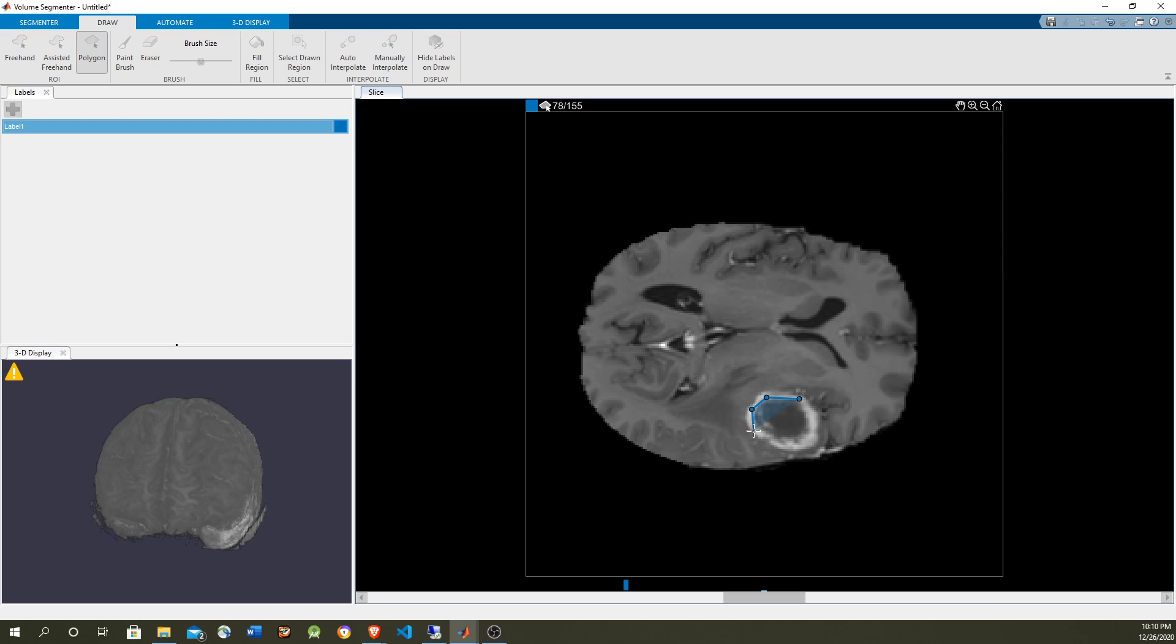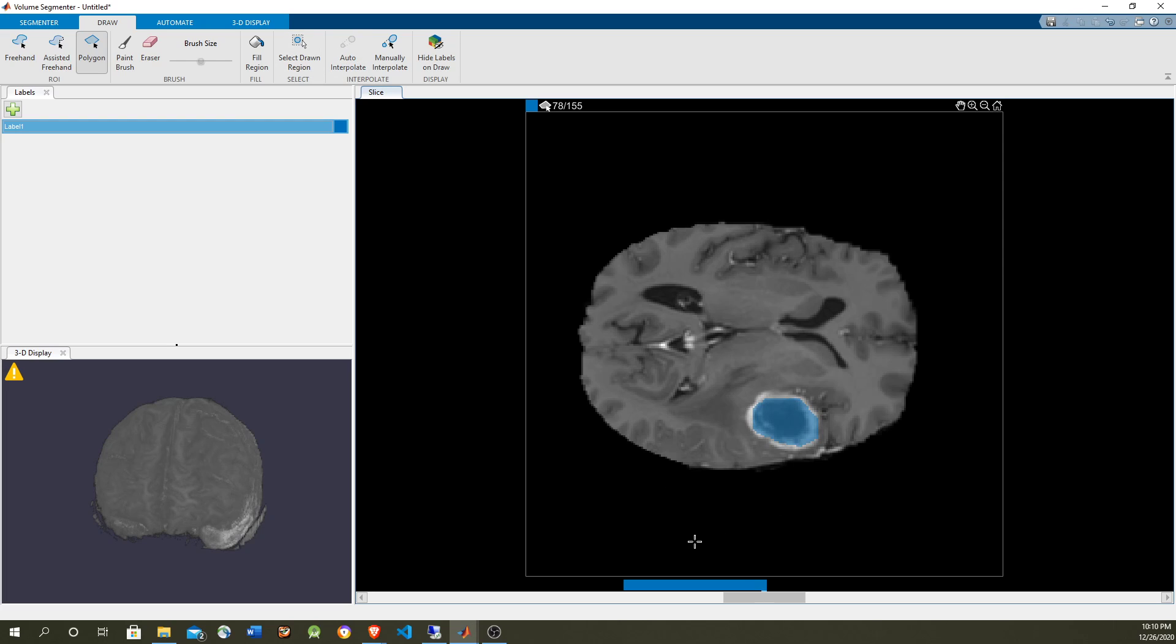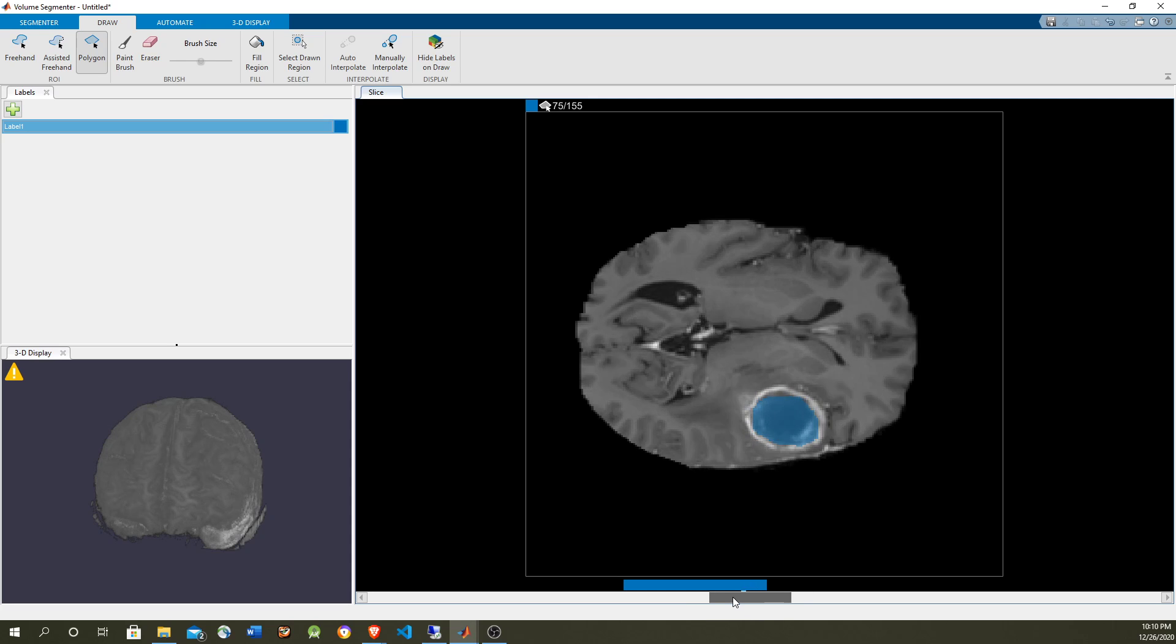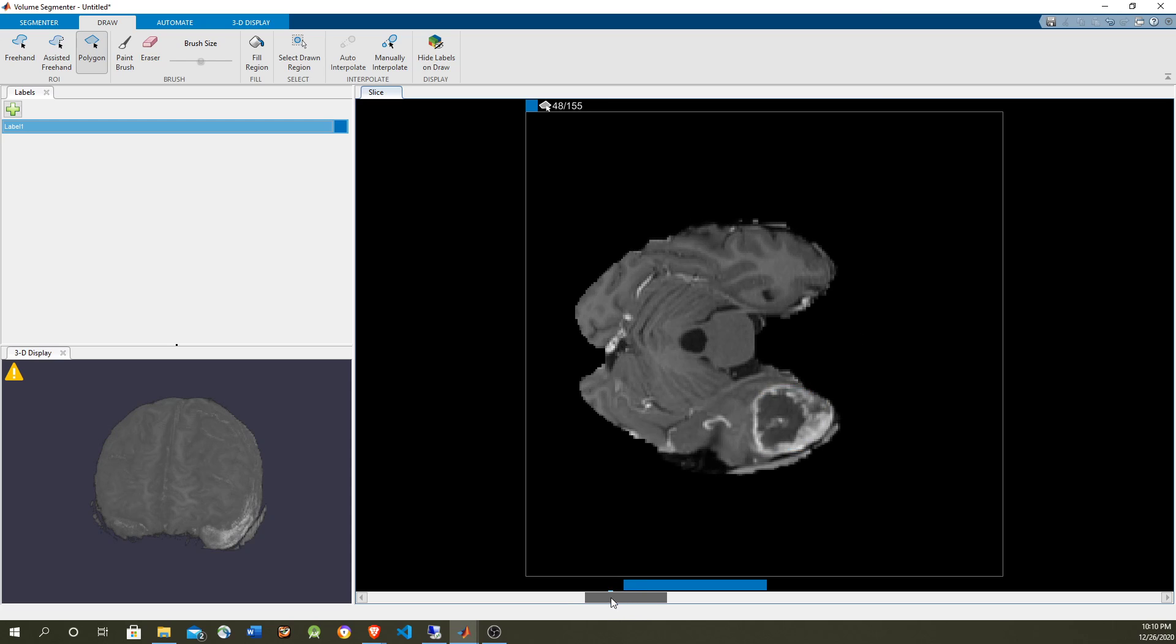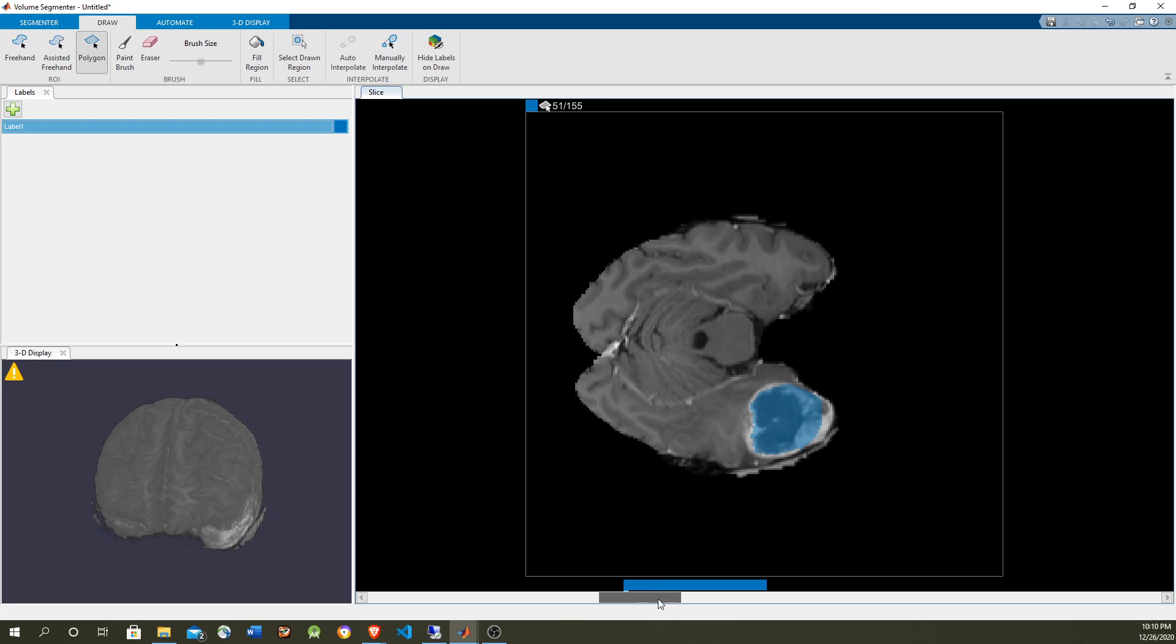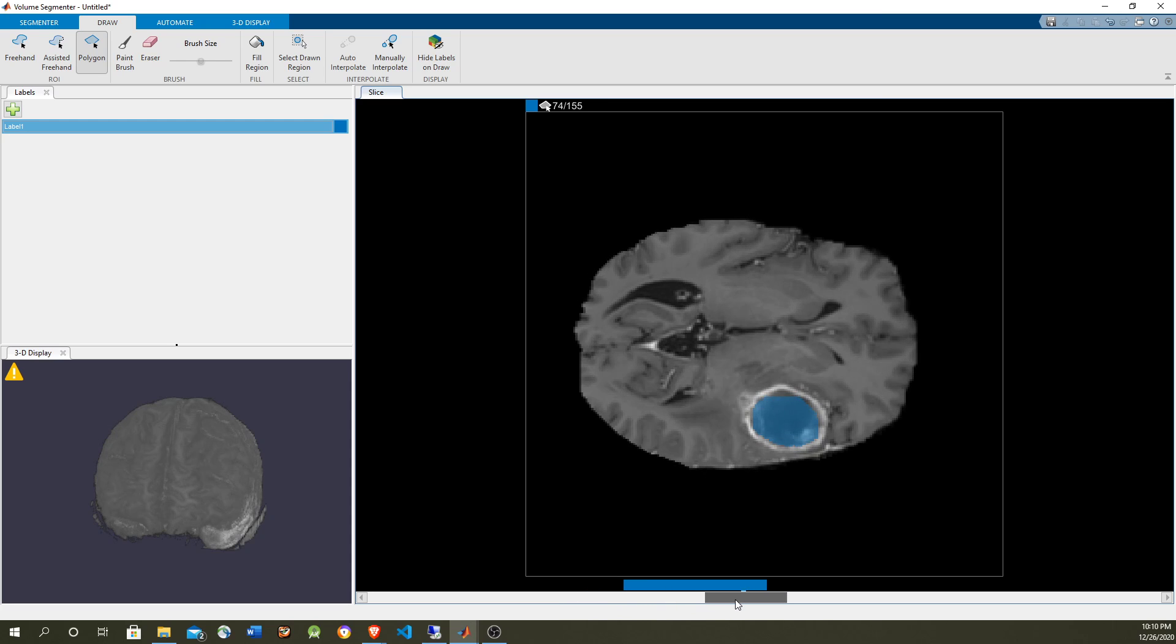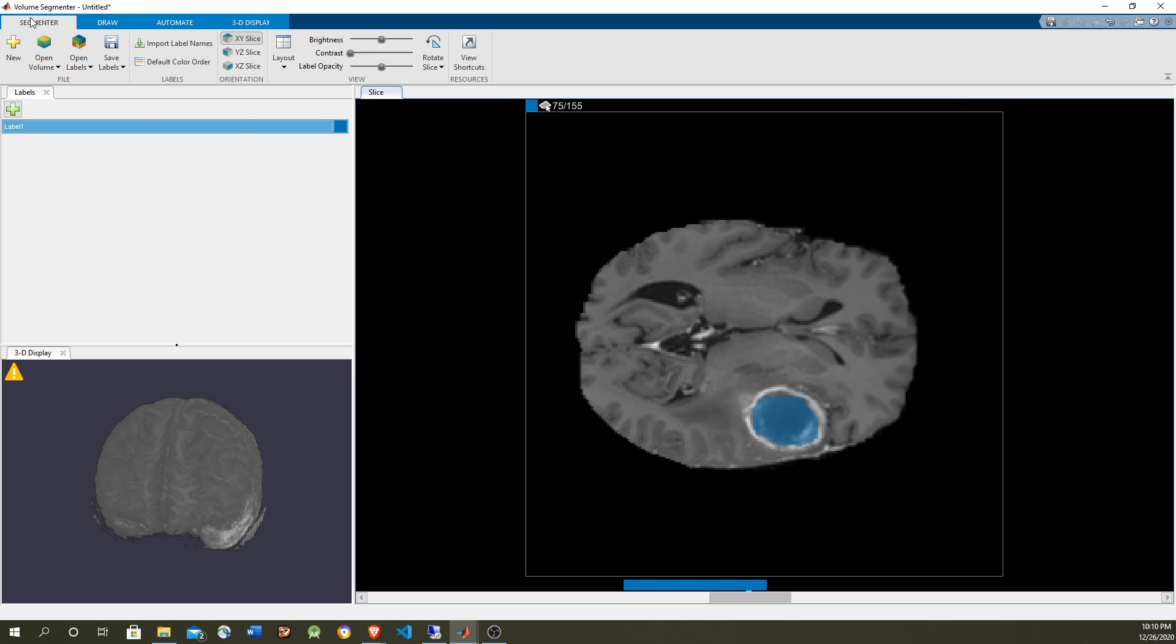This is not going to be perfect but it's just to show how we can create the label volume. Now we're going to use auto interpolate to create the volume, and you can see that instead of having two separate planes we have a full volume. It's not perfect but it's just to illustrate.